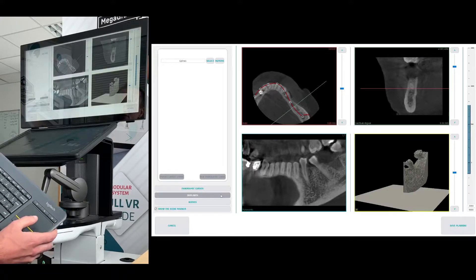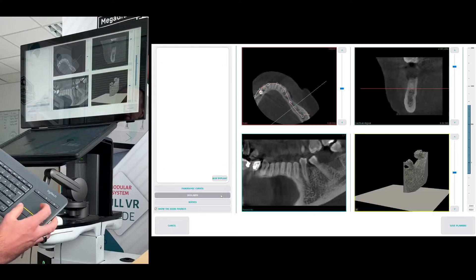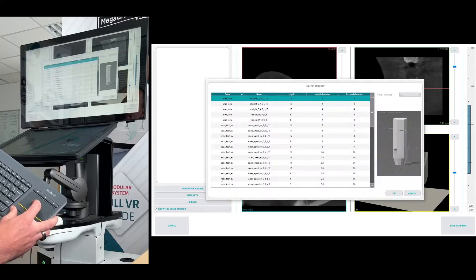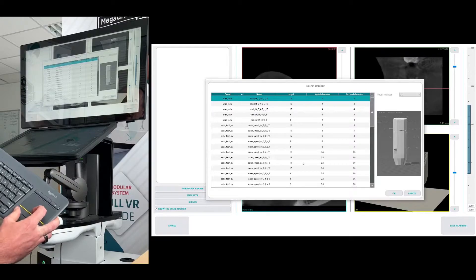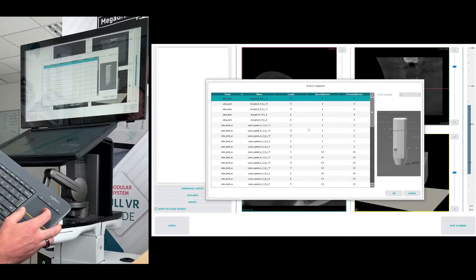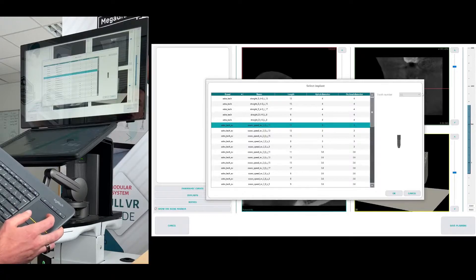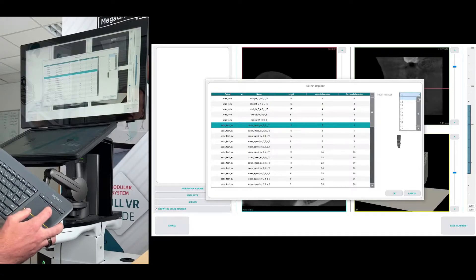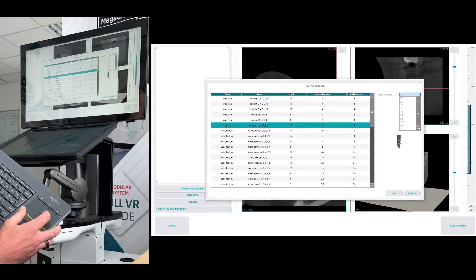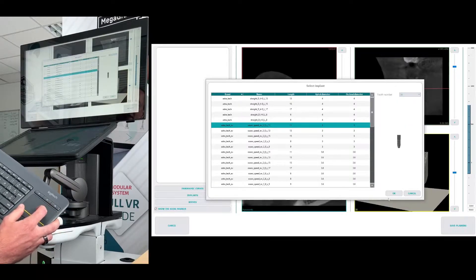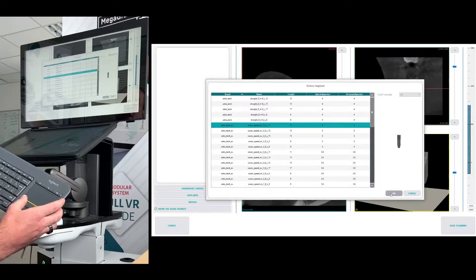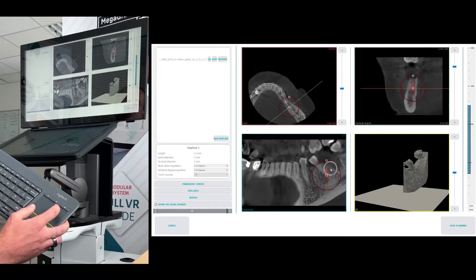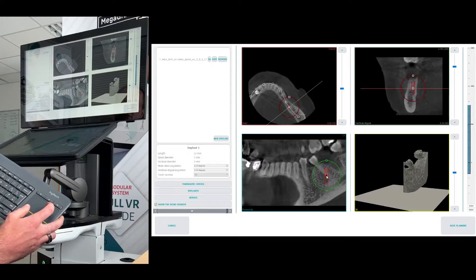So I can now go to the bottom left and click the implant. Click new implant. And then I have a library of all the implants we've got. So these are the Astratex and we can import new ones in the future if you need to. In the top right, we're able to choose the tooth number we're working on. And this helps orientate the implant as well as using it for the comparison to make sure we're working on the right tooth.